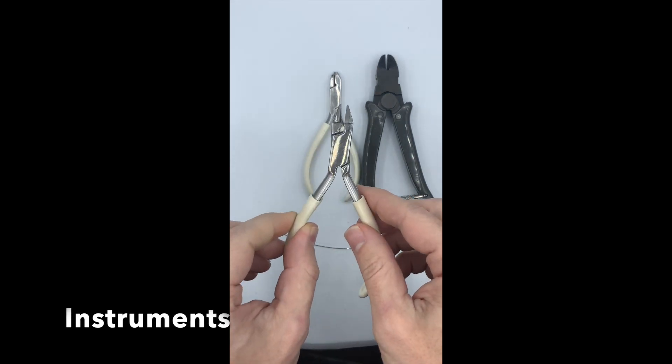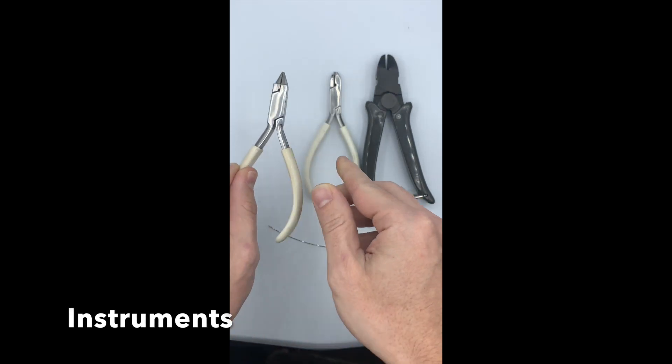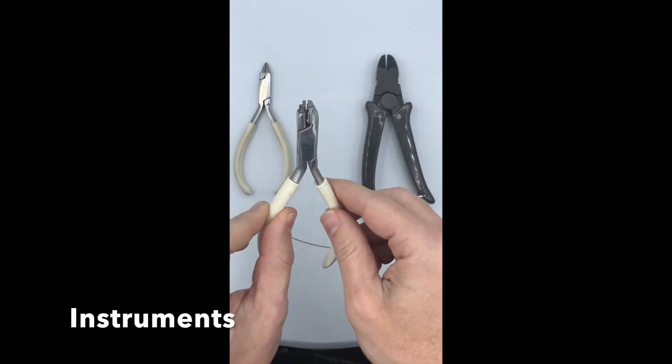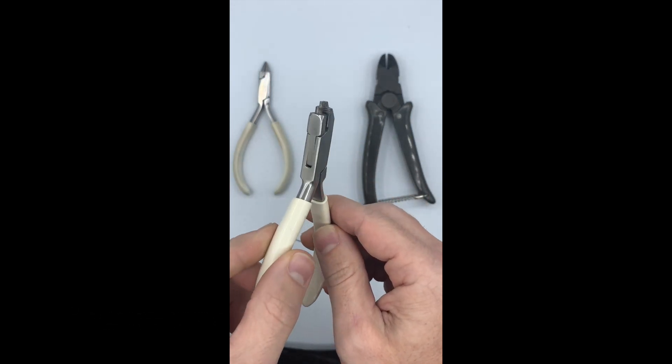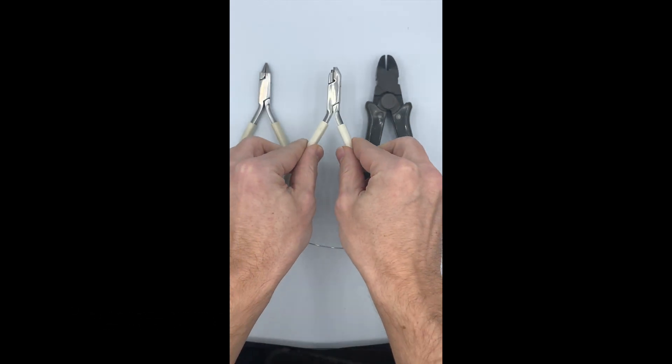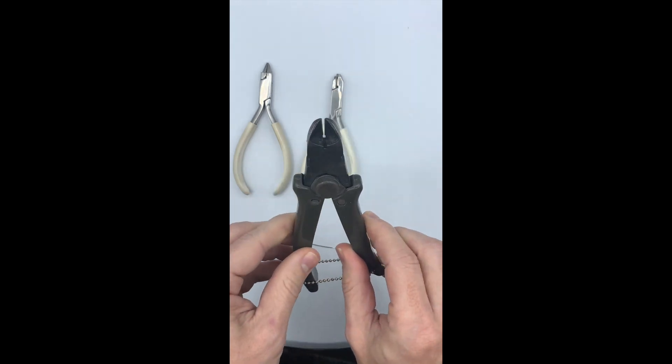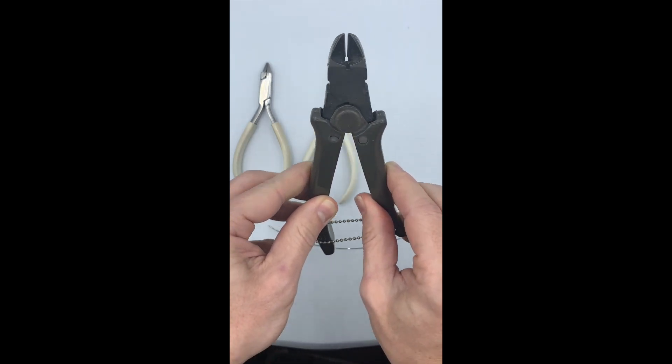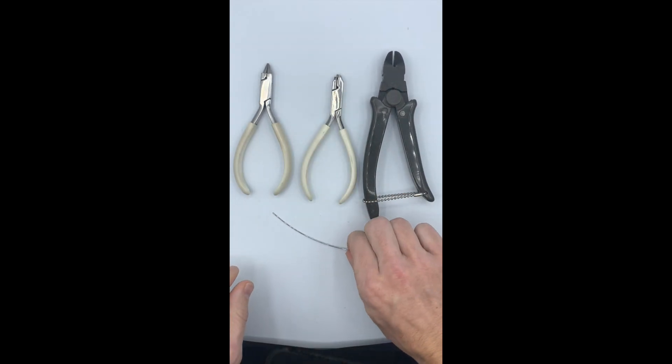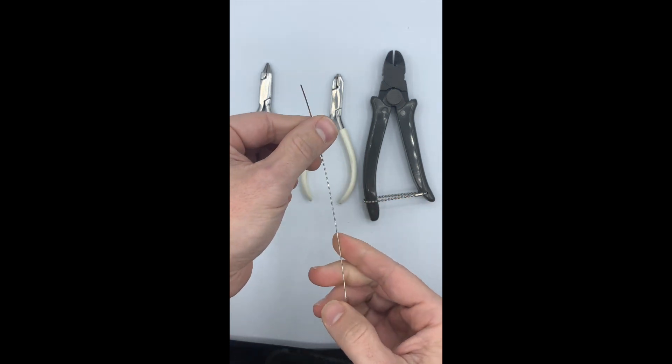The basic instruments for bending a bow are a 139 plier, a Hawley loop forming plier if you have one, a wire cutter, and a 6 inch length of 0.032.